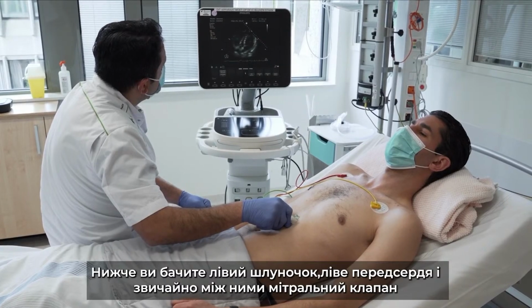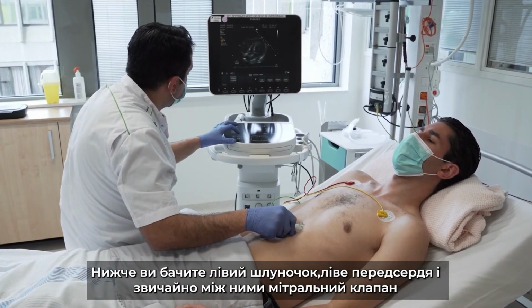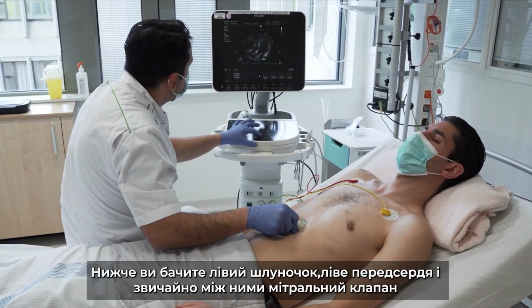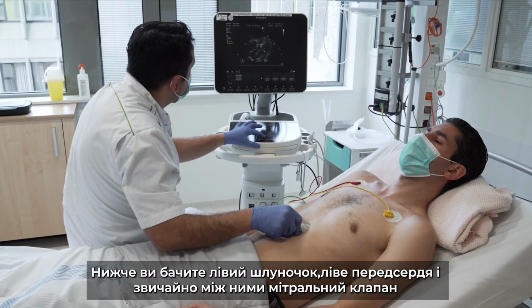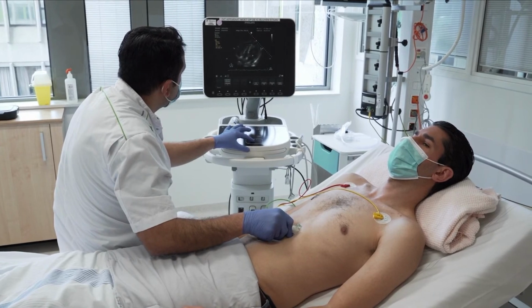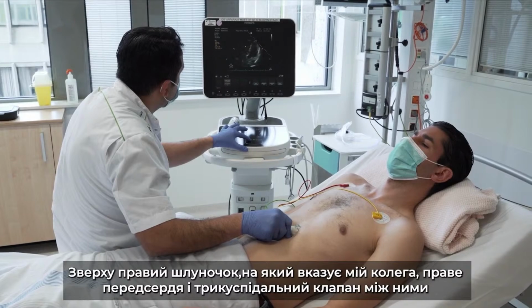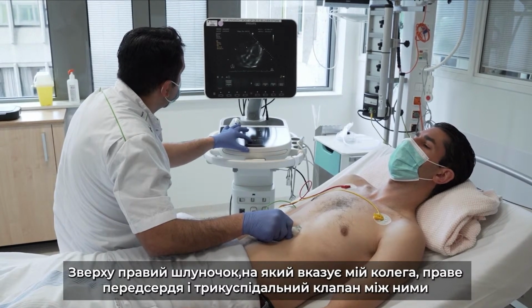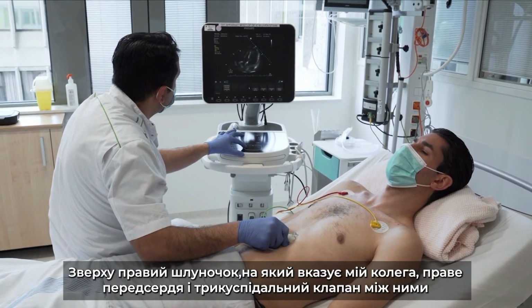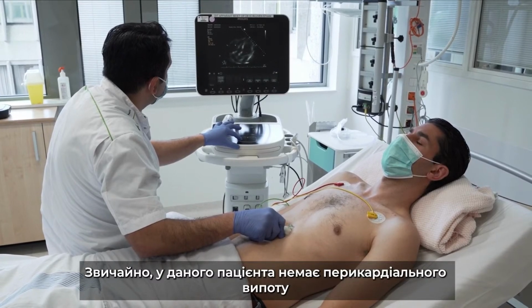Below you see the left ventricle, maybe you can point them out, and you see the left atrium, and of course in between the mitral valve, and then on top of that is the right ventricle, which my colleague is showing now, and the right atrium, and in between the tricuspid valve. Of course, this patient has no pericardial effusion.